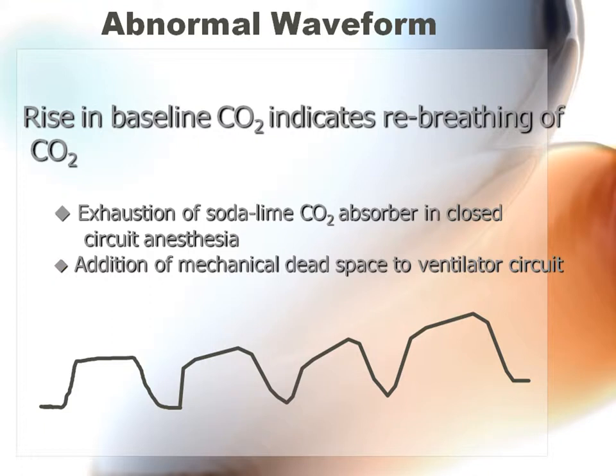But the thing is, if you're kicking off a lot of CO2, why are you doing it? If you're not kicking off a lot of CO2, why are you not doing it? As far as patterns are concerned, the only ones they ever really pick up are the bronchospasms. If you see somebody waking up from neuromuscular blockade, that's kind of neat to see. Move along in life. But understand what causes it.